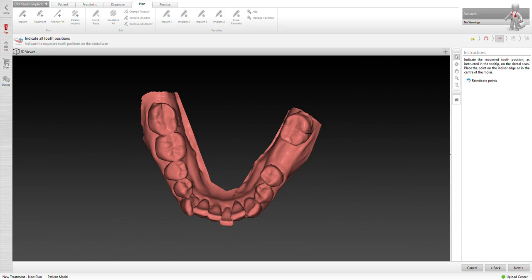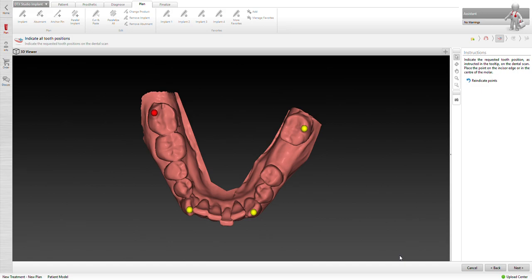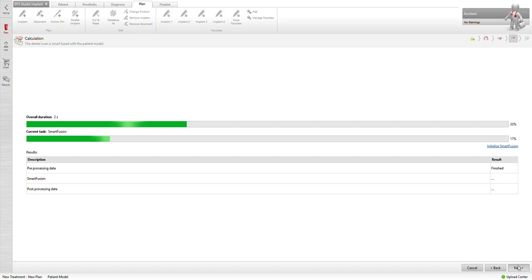We'll go ahead and hit next. This is where we need to identify the matching points so it can merge the intraoral scan with the DICOM file. I like picking prominent portions on the teeth, the cuspid, and just follow the instructions that it says on the cursor.